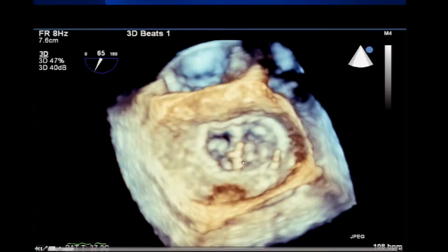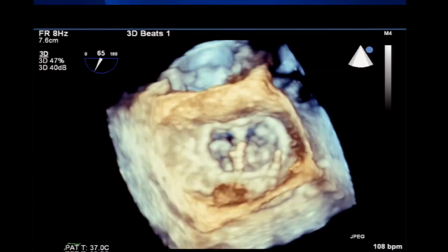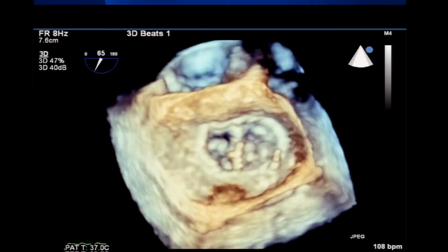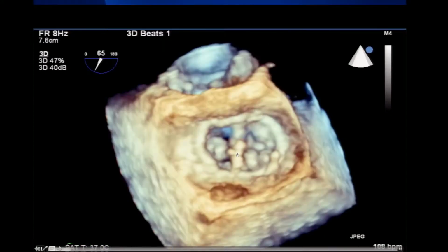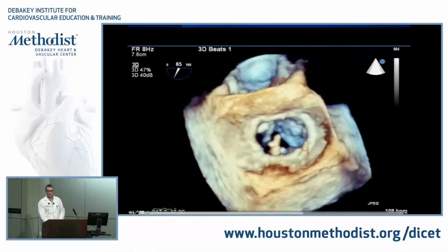All right, so what are these? Do these meet the criteria for endocarditis? Is this a vegetation? Anybody? Sutures. That's one suture? You're not on the wrong track. What it is, is a knot, right? So that's doing the... It's not mobile at all.